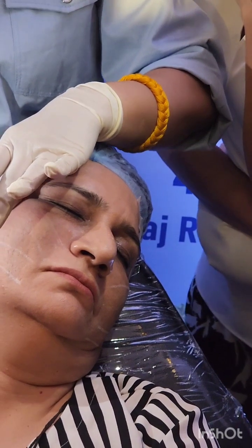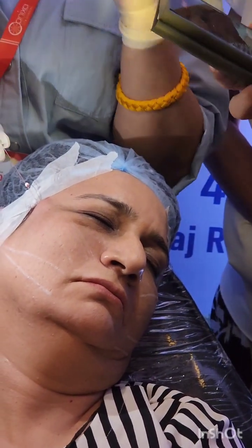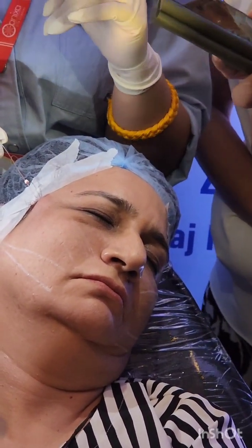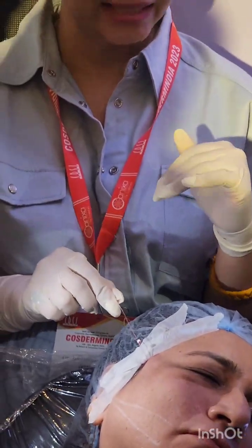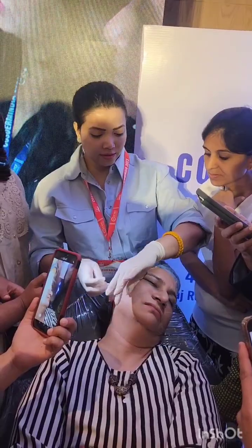The difference between the cog and this is the tensile strength. This is a tensile thread, and the strength is good. It dissolves over a longer period of time. It stays for a longer period of time, 1.5 years, people say. Even the literature has suggested one. It is a molded thread, so it can hold 9 kg weight. 9 kg.